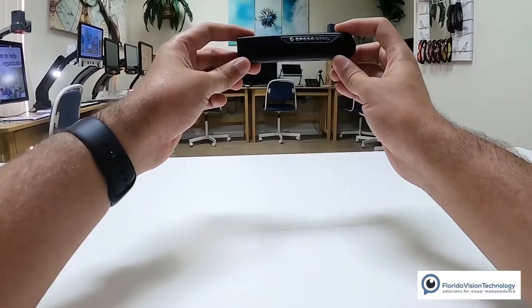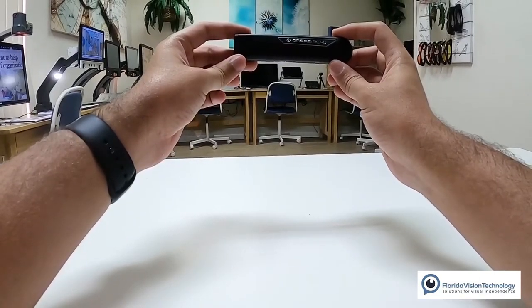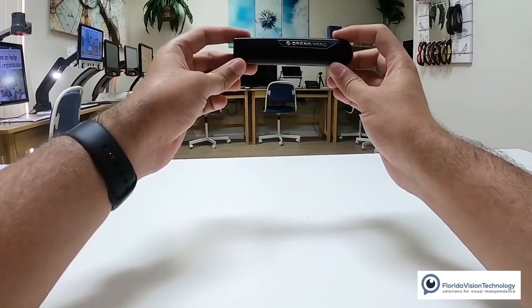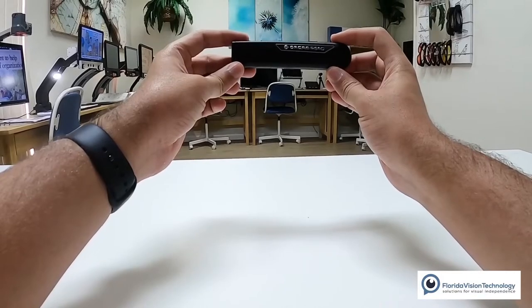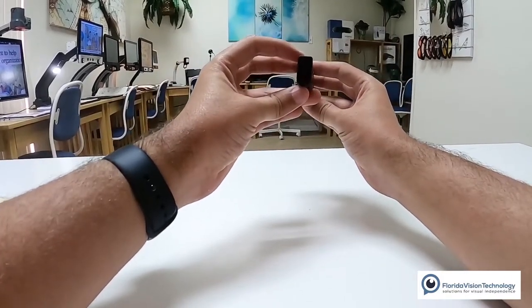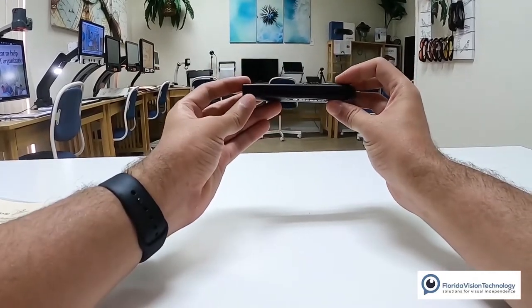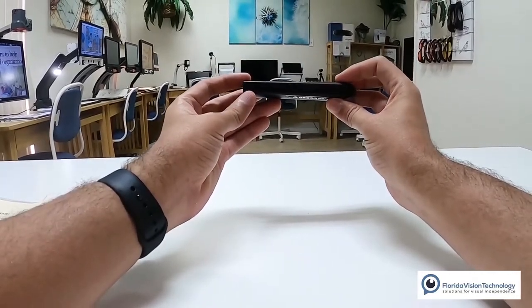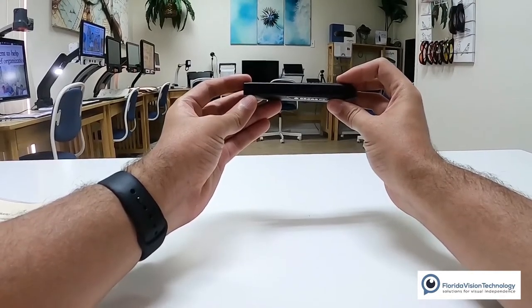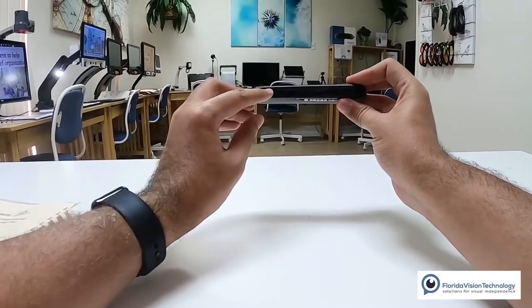So this is the OrCam Read — I have it in my hands in front of the camera. For those of you who cannot see, the OrCam Read is probably the length of a marker. It reminds me of a thumb drive that you might stick into the computer. On the front of the device we have a camera that we're going to use to take pictures of text. Along the top of the device we have four physical buttons, and I really appreciate that — it's not a touch bar like the other OrCams. This one has four physical buttons.